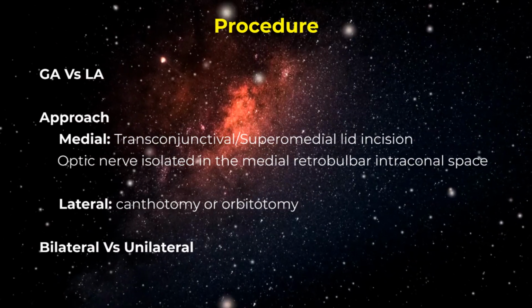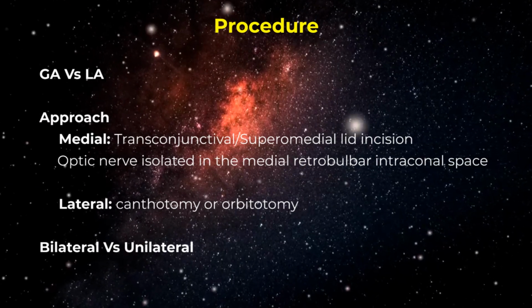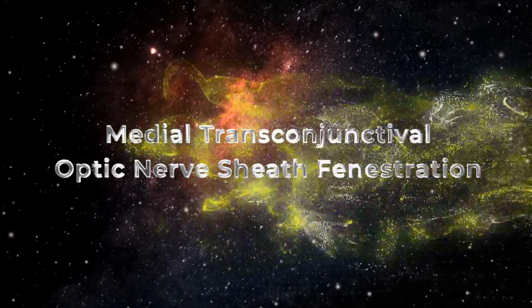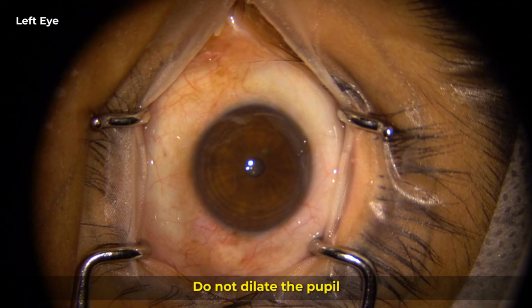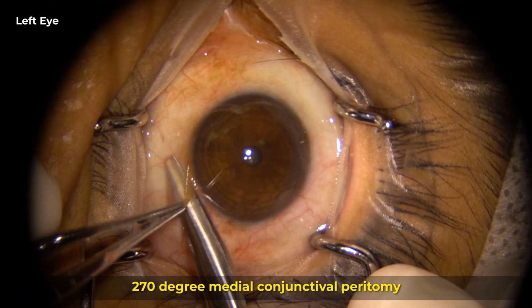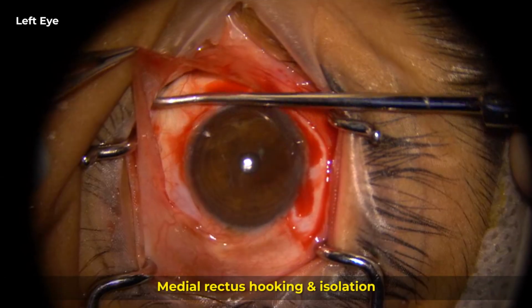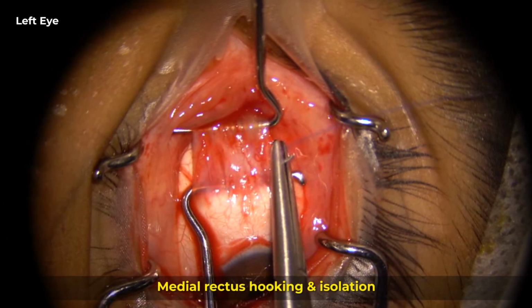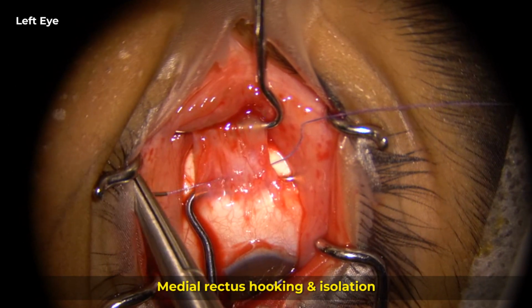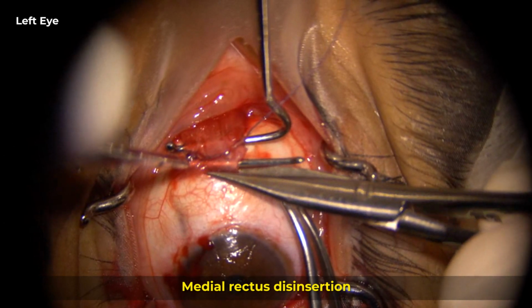ONSF can be done either under GA or LA by the medial approach or the lateral approach. I shall be describing the medial transconjunctival optic nerve sheath fenestration. Please do not dilate the pupil. A 270 degrees medial conjunctival peritomy is performed by sitting temporally. The medial rectus muscle is hooked and isolated. Interlocking 6-0 sutures are passed through the medial rectus muscle and the muscle is disinserted.